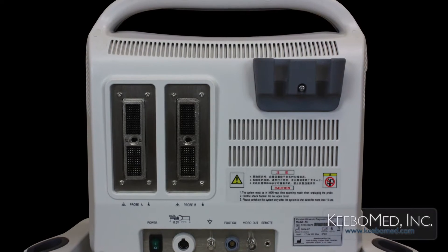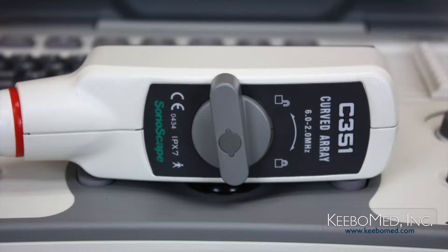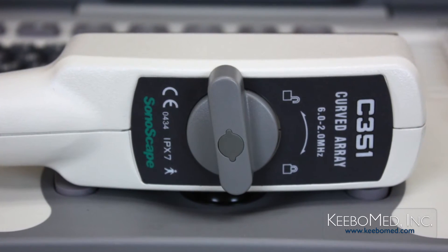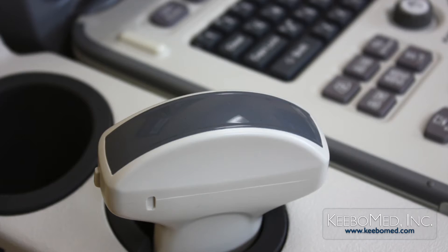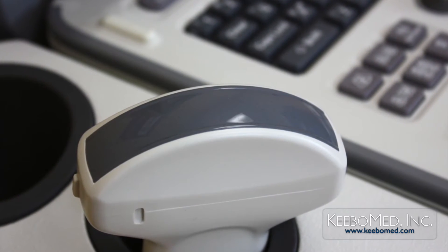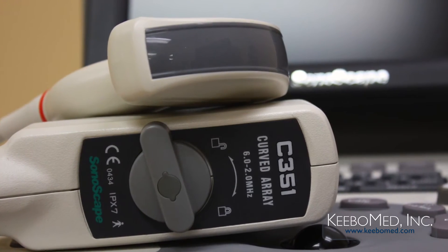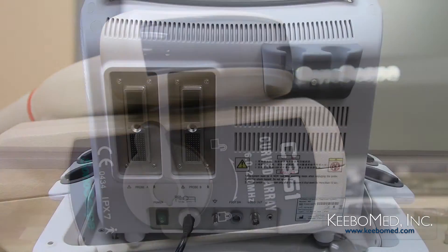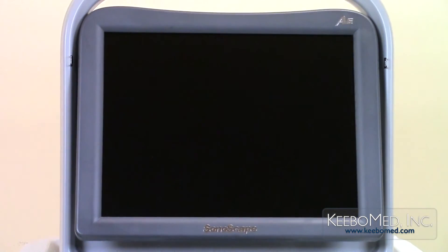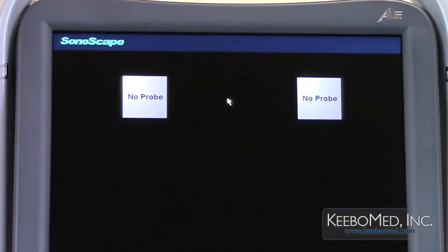On the back of the A6 ultrasound are two transducer ports. Learn how to properly connect the probes to the A6 in this video. The A6 supports a variety of different probes. Use only the probes provided by Sonoscape for the A6. Probes can be connected while the system is powered off or powered on. Step 1: Turn on the unit and the exam screen will be displayed. The system will recognize that there are no probes connected and will display this on the screen.